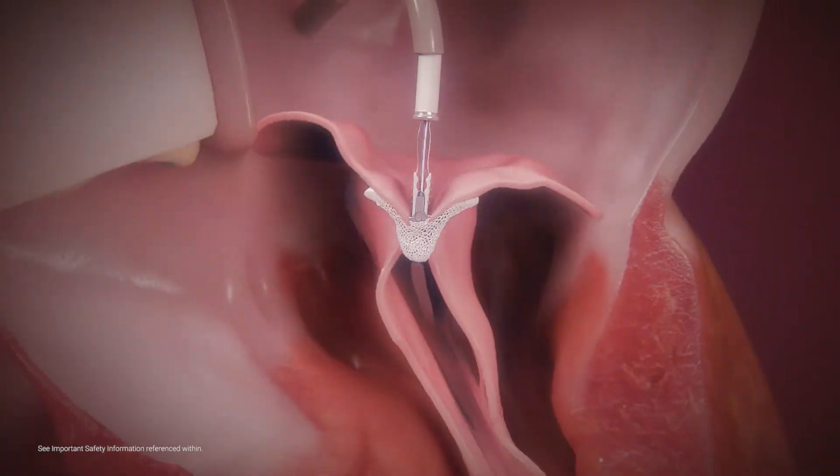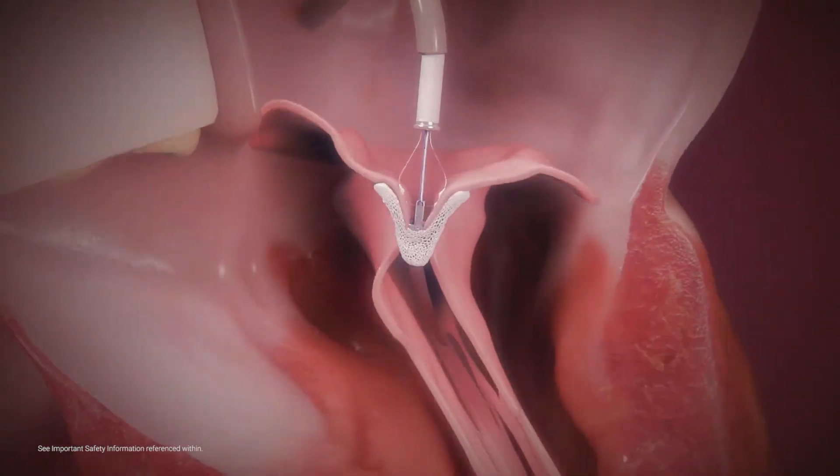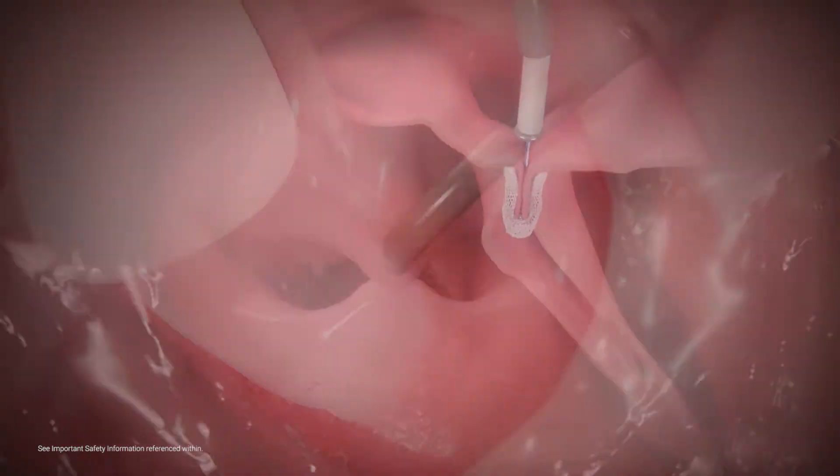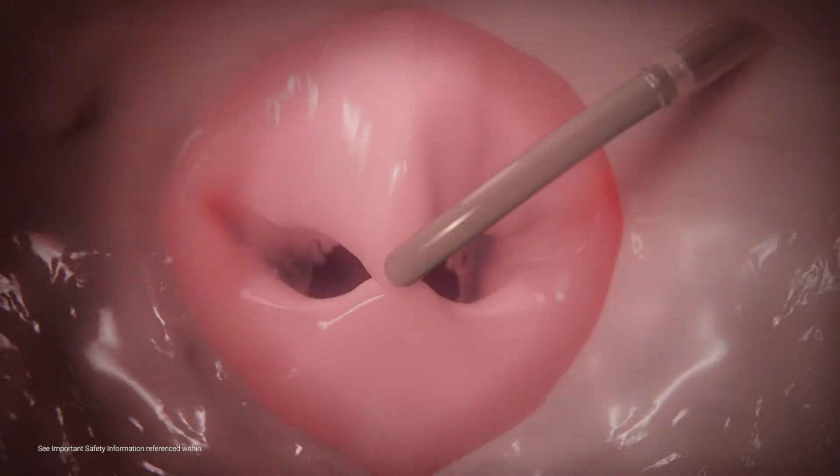MitraClip grippers are designed to drop firmly into the clip arms, securely capturing both leaflets. Once the arms are closed, they create a double orifice within the mitral valve.